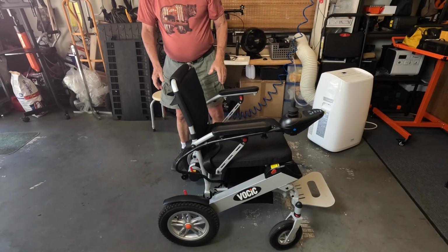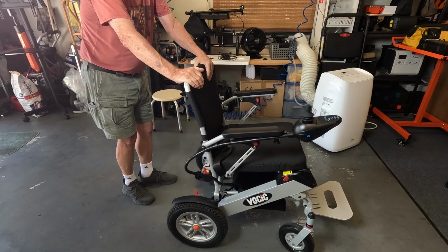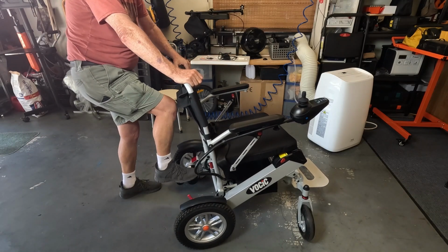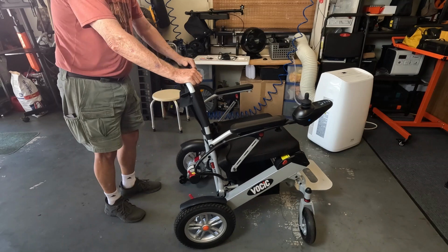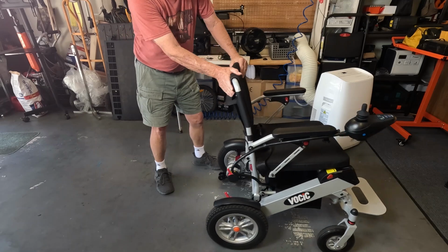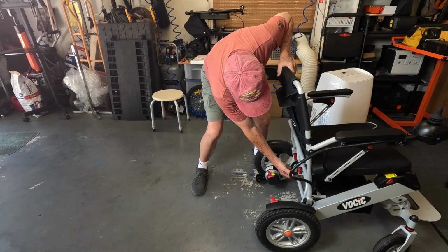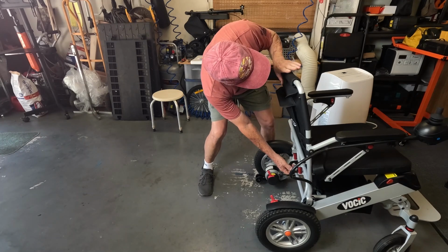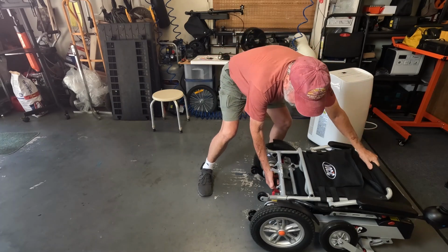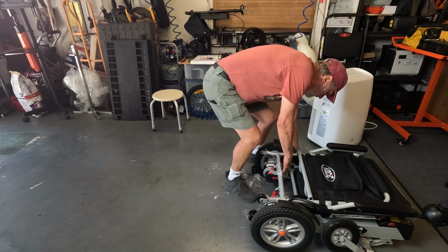Okay. We need to get it into the neutral position. So to do that, I push this down and this down. And now it's free to wheel. And the way we do this to store it is you grab this and then push on this down, pull this out, just like that. And that's how easy it is.